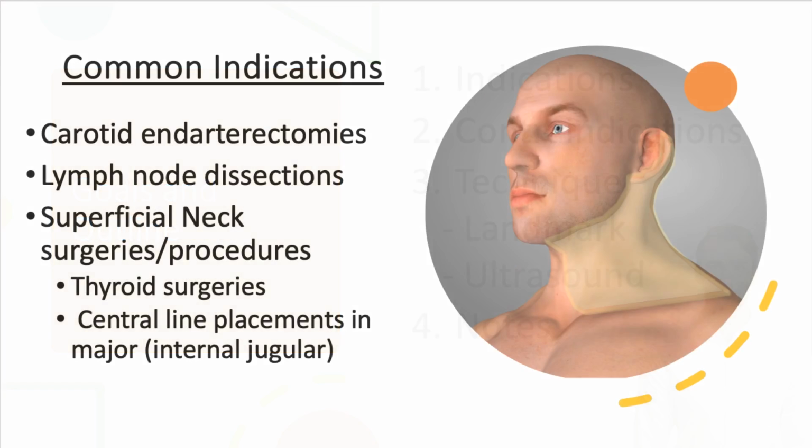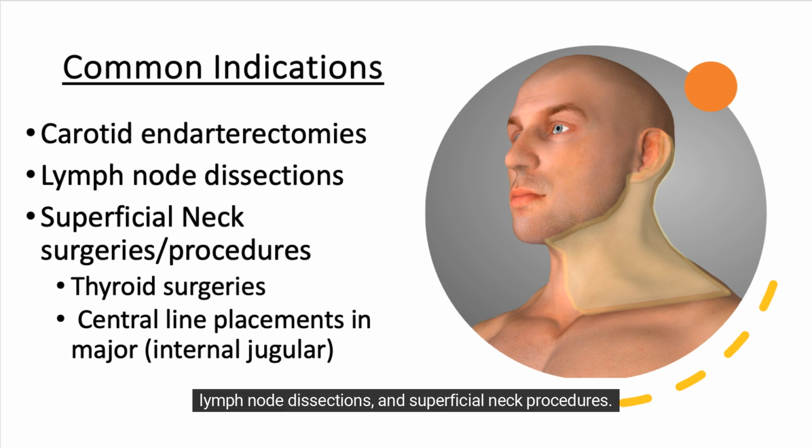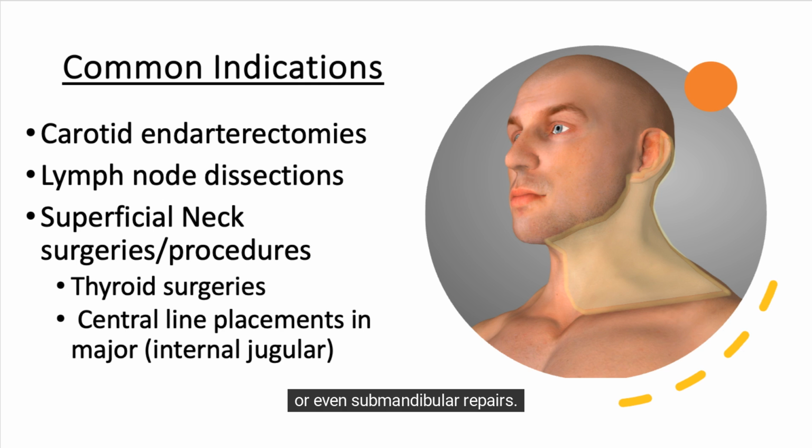block. Common indications for surgical and postoperative analgesia include carotid endarterectomies, cervical lymph node dissections, and superficial neck procedures. In the emergency room, this block can be used to provide analgesia during earlobe repairs, central line placements, or even submandibular repairs.